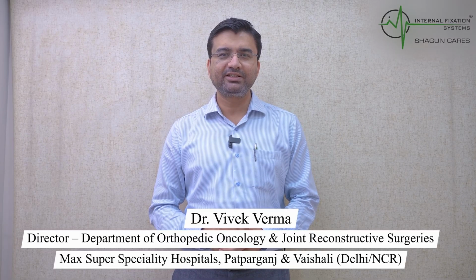I am Dr. Vivek Verma, Director Orthopaedic Oncology and Joint Reconstructive Surgeries at Max Hospitals, Delhi. Today, I am going to demonstrate the different types of products that we use in tumor prosthesis and revision joint surgeries. Now we are going to show you how we reconstruct the proximal tibia.